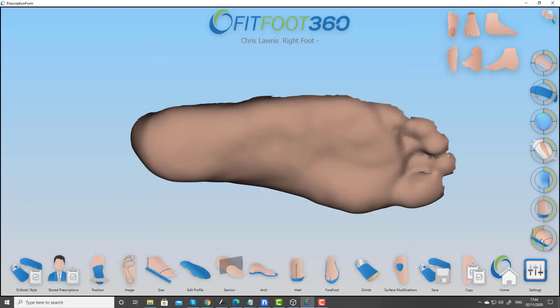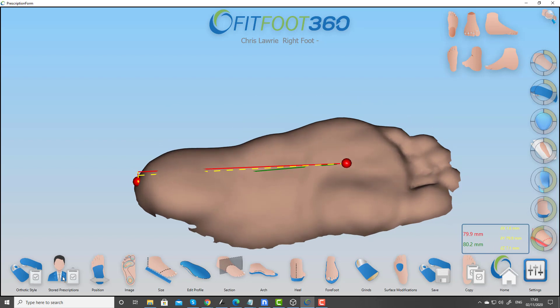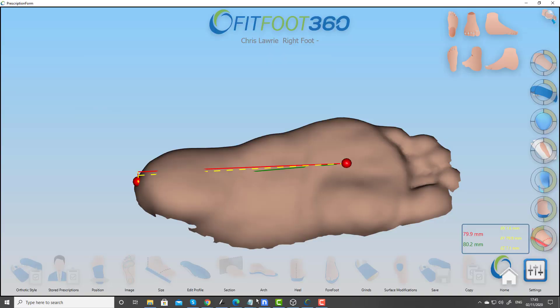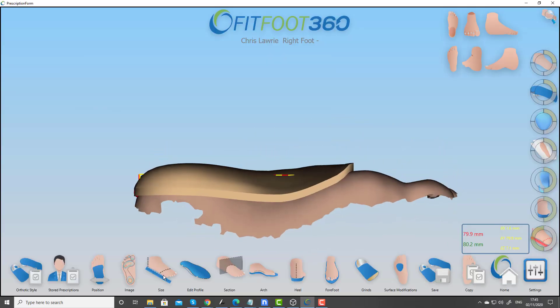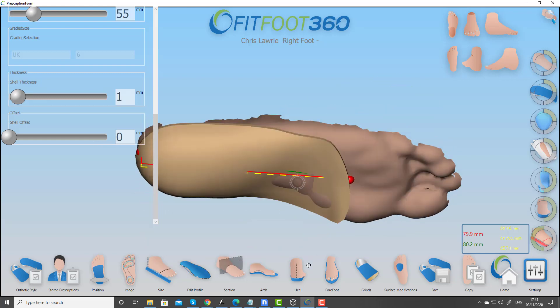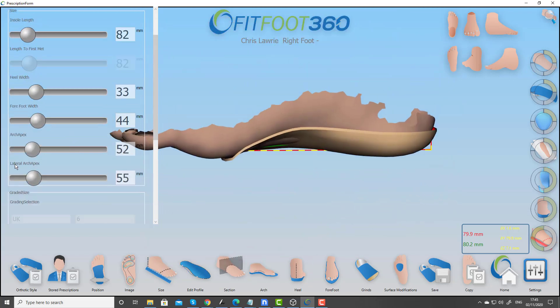One of the features that a lot of you asked for was the ability to deal with children's feet. In the past it was always difficult with our style files to get the blend between the arch and the heel right. But now the new style file added in version 3 allows you to work on a very small foot — here only 80 millimetres long — in the same way as you would on an adult's foot, giving you full clinical control over the design.